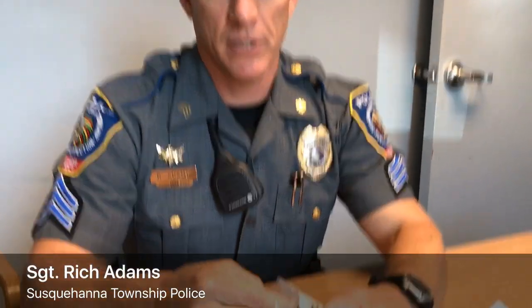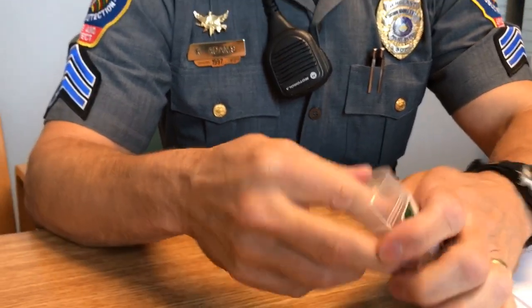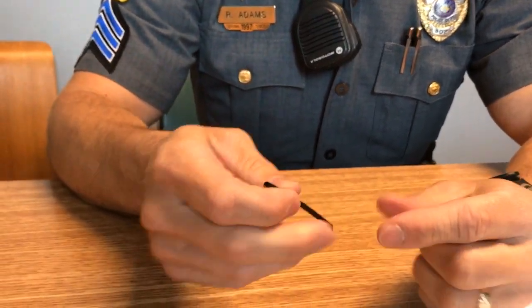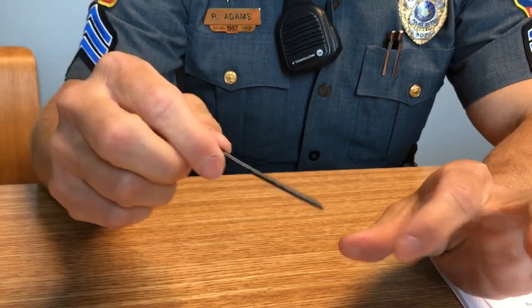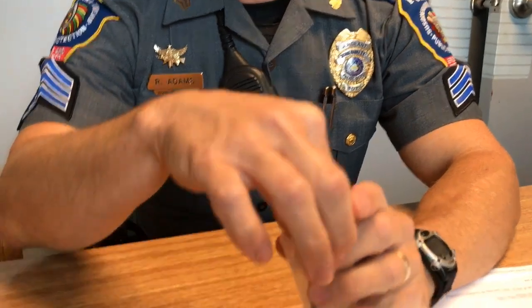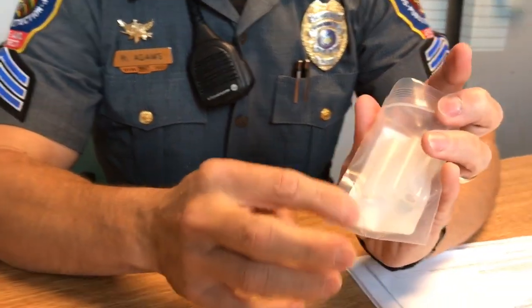This is a heroin test kit, which is also good for morphine. We take this little straw out because heroin baggies are usually oblong and very difficult to get powder out of. They give this little spoon so you can get down into the baggie. You only need a little bit on the end — just open up the bag and dump a little bit in the bottom.